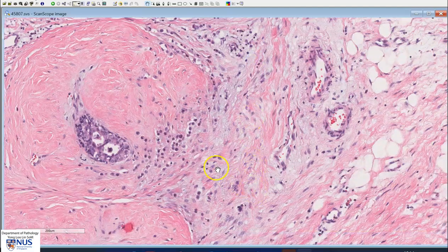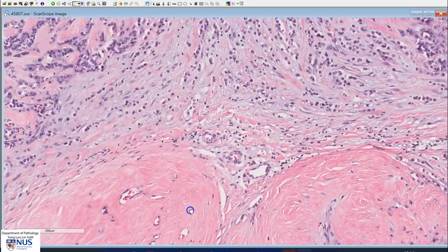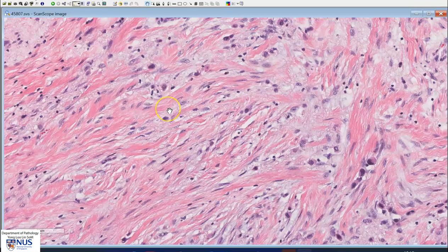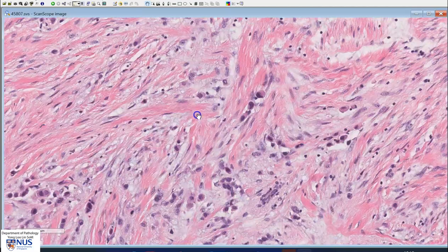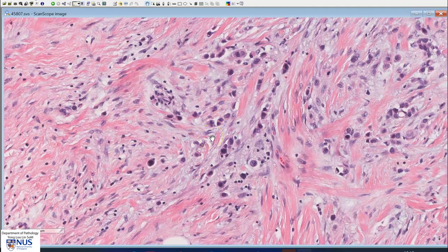Usually in lobular carcinoma, there is loss of E-cadherin on immunohistochemical staining. That is a membrane stain, and this gives rise to the very discohesive appearance of these tumor cells. It can be occasionally challenging to recognize these malignant cells, because they can be sometimes singly dispersed sitting within the breast stroma; hence it is important to look carefully for these cells. You will also notice that the nuclei tend to be a little bit less pleomorphic in general than those of ductal carcinoma or invasive carcinoma of no special type, and also the cells are smaller.